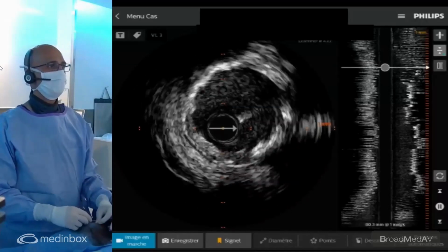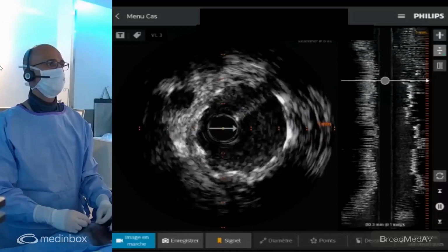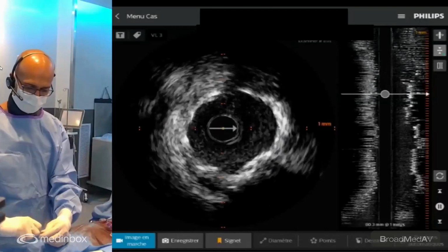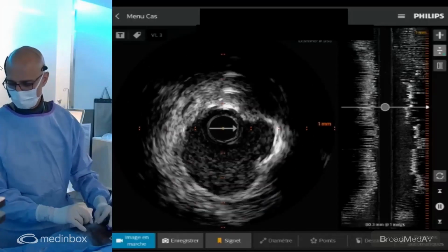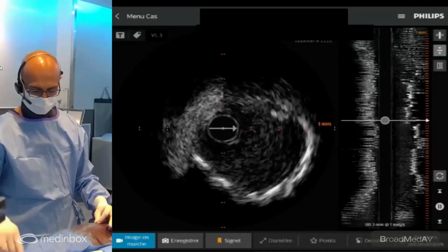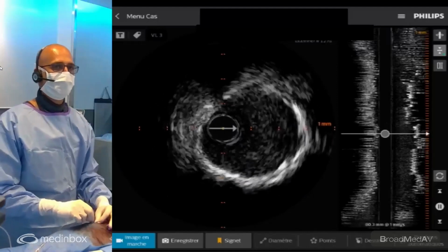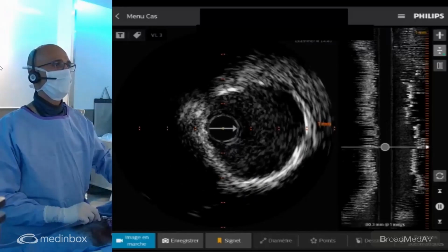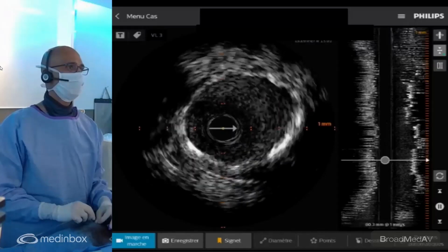Okay, here's the part where we had malposition. Yeah. Okay, let's go to 20 here. Let's see if the balloon expands well. Let's disconnect. Okay, off. Yeah, it's good. Do a small test. Make sure we have no issues. Okay, there are no issues. Very nice.